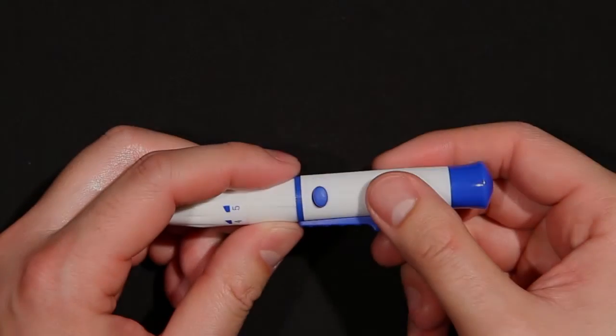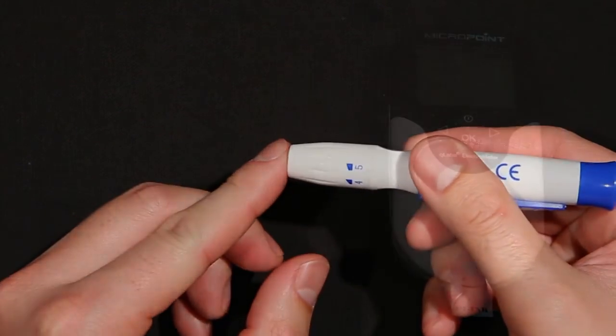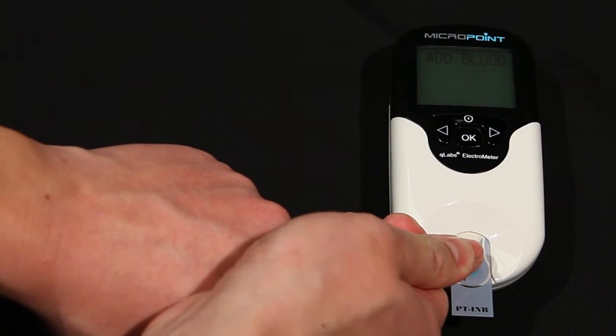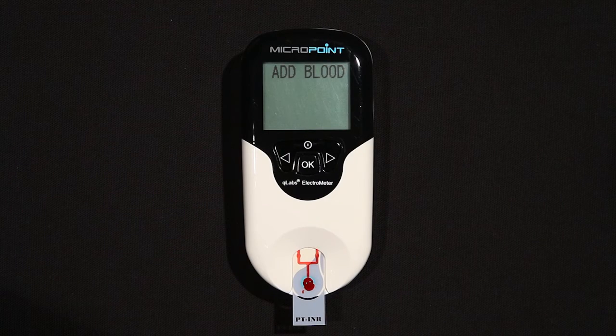When completely dry, use a lancet to obtain the blood sample. Place the hand below heart level, and make sure to apply the blood sample directly on the sample well of the test strip. The blood sample must be applied to the test strip immediately after collection. Otherwise, the blood sample may begin clotting, causing inaccurate results. Be aware that plasma or whole blood samples with anticoagulation reagents are not suitable for the Q-Labs PT-INR test.